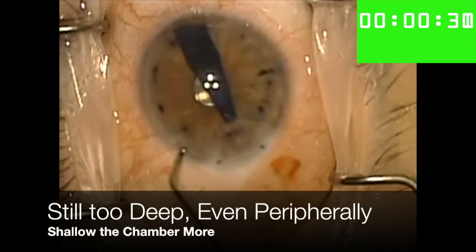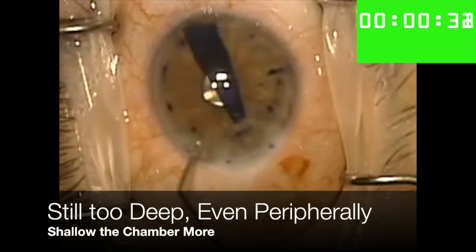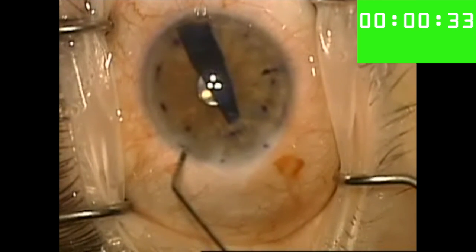Ultimately, here I make the decision to shallow the chamber even further because the chamber is too deep for the scroll to open successfully.